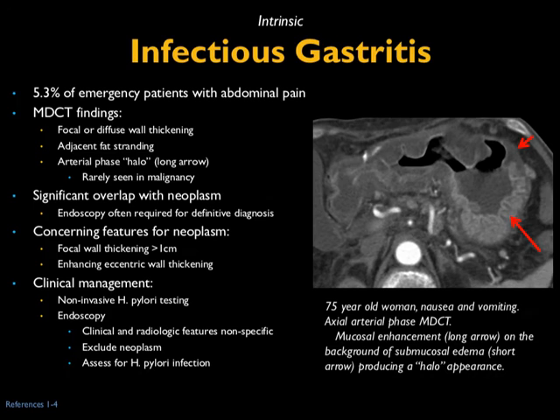This patient would end up getting endoscopy in clinical practice. This was a case of gastric wall thickening due to infectious gastritis. Key findings: focal or diffuse wall thickening — in this case diffuse — with some adjacent fat stranding, which is not uncommon. You don't need a perforation to see gastric stranding, and sometimes on arterial phase imaging you'll see a halo appearance, though that's fairly uncommon.